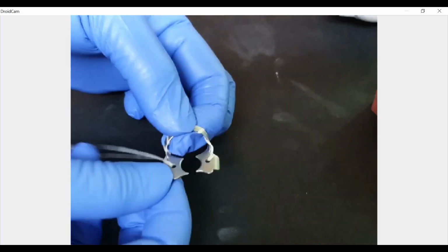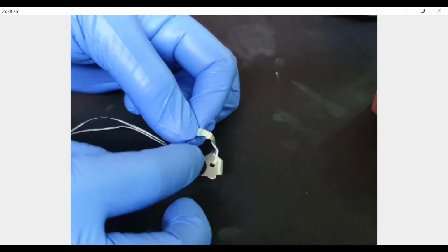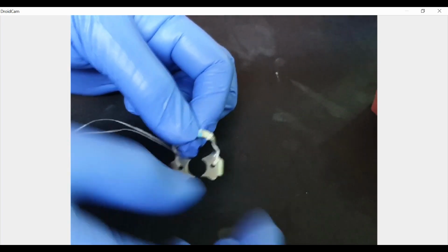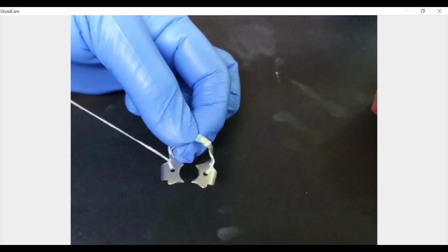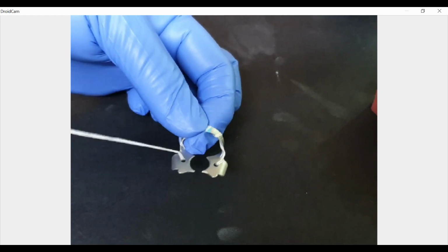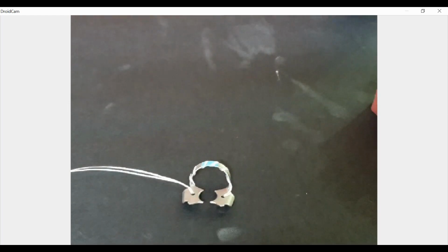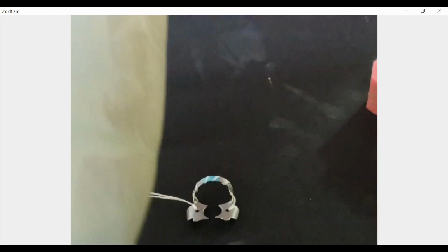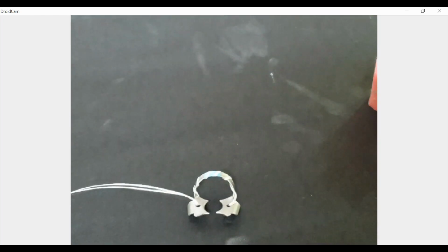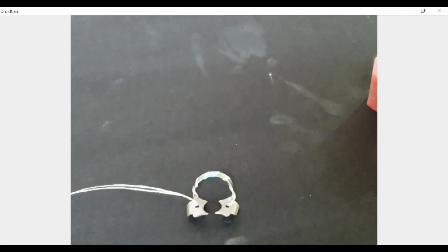And if you can notice, I purposely keep it distally so that it does not interfere with any procedure. Suppose I'm performing root canal with an endomotor, this thing should not come here. So it should always be placed distally. And then once you've completed the isolation, you have to bring it out and tuck it under your frame. So this is how you secure the clamp. So far so good. We are clear with everything.